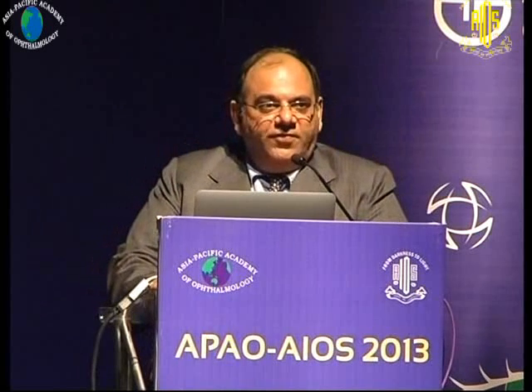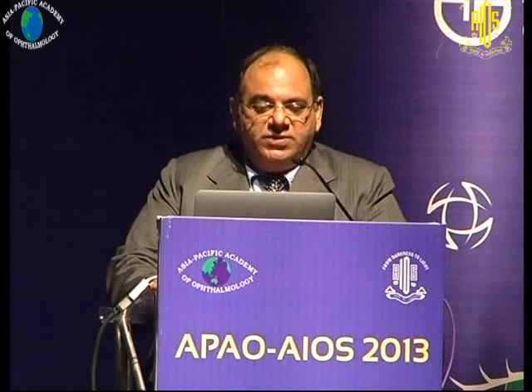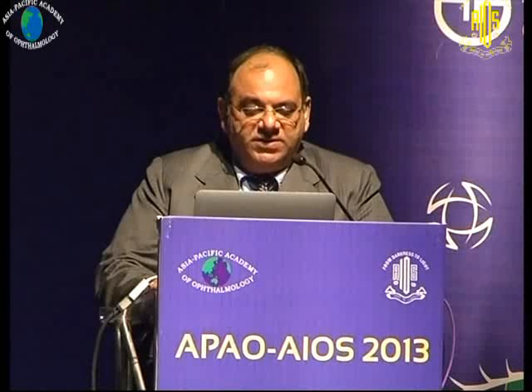When you are considering a phaco in a vitrectomized eye, it's already a problem. So a combined approach is a better idea, because vitreous support, which is not there, can lead to an unstable posterior capsule that is unusually mobile and flaccid.